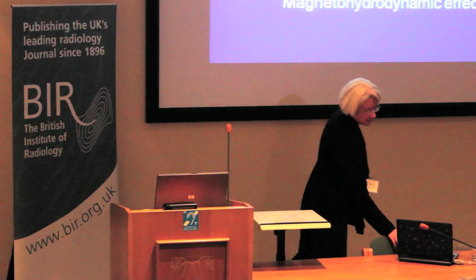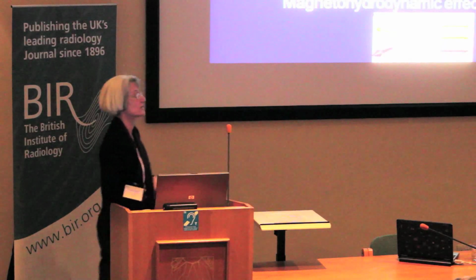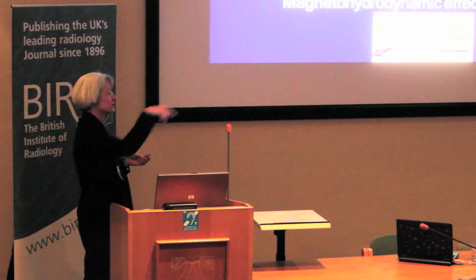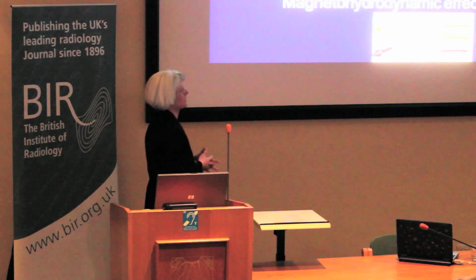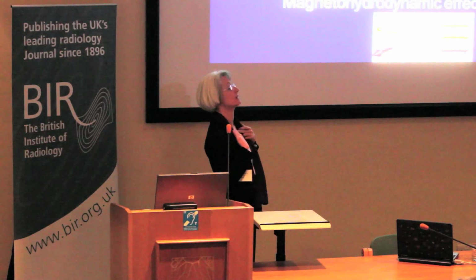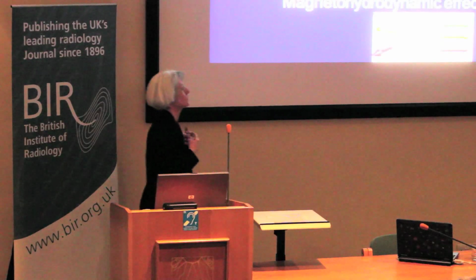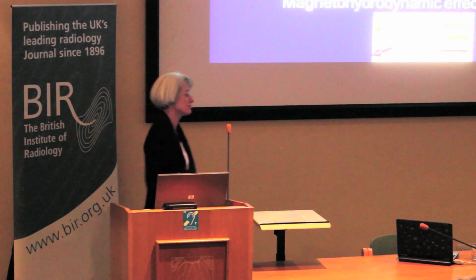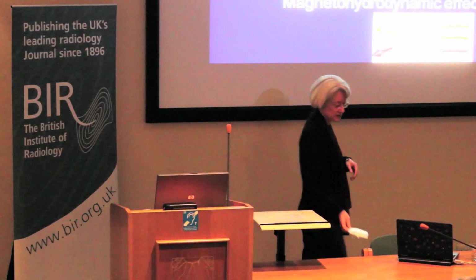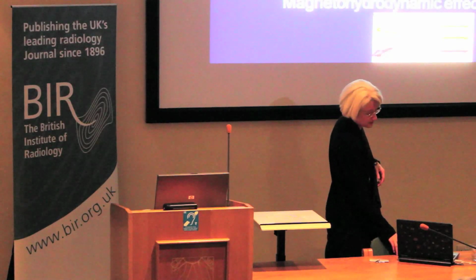And the third effect is the magnetohydrodynamic effect, which is kind of the reverse of the one above, which is if you've got a conducting fluid moving in a magnetic field, you get a force on that fluid. The most likely place for that is at the top of the aortic arch. So as you're lying in the magnet, the field's that way, the blood's flowing across the aortic arch that way, you'll get a force on that fluid. But actually that force doesn't become significant until you get to about 16 Tesla, it's been calculated. And it doesn't produce a significant effect on blood flow or blood pressure.